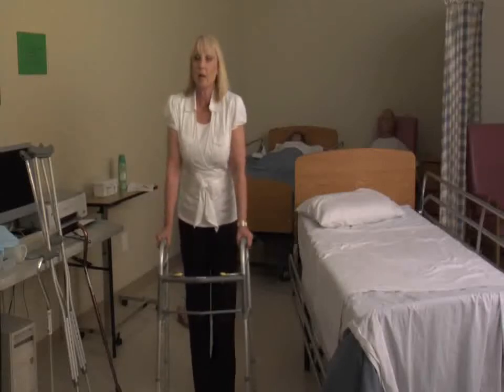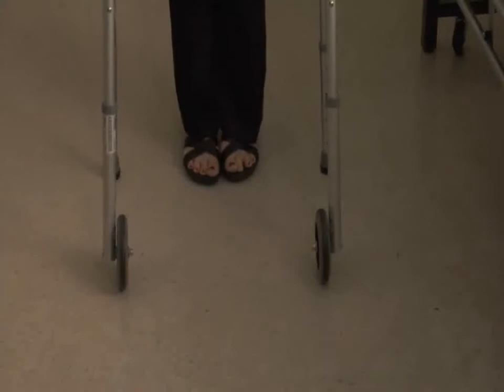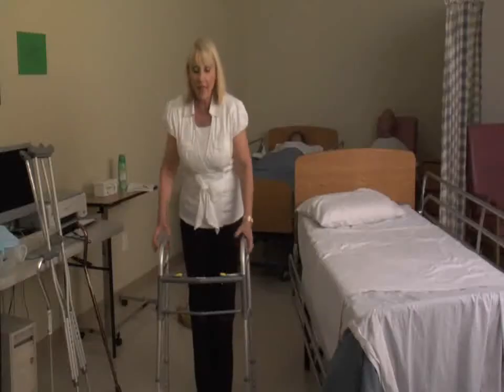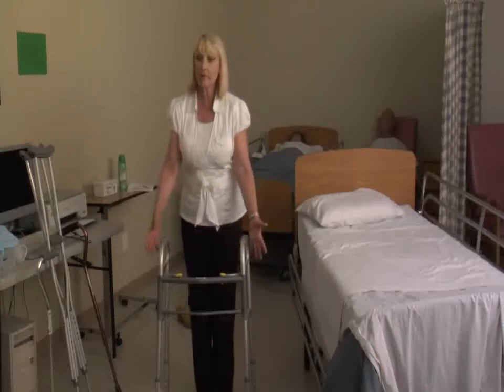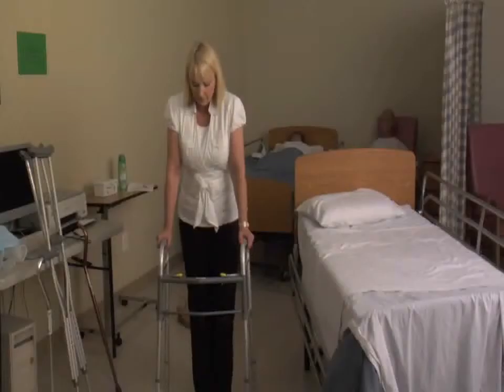And now we're going to use a walker. And there are lots of different kinds of walkers. Some walkers have wheels, some walkers have tennis balls, some walkers have hand brakes, some of them just have the legs. But the main purpose of the walker is just to help support a patient when they're ambulating.